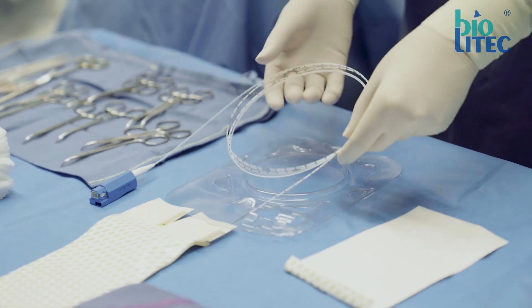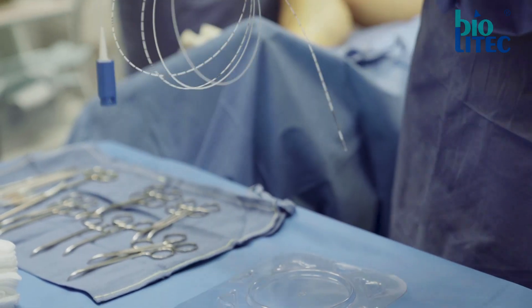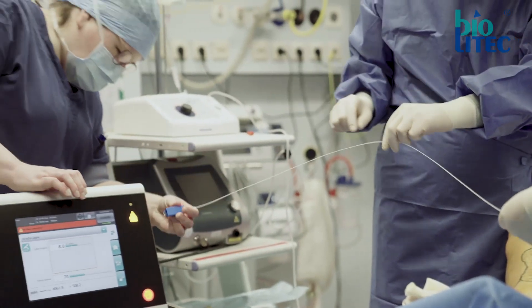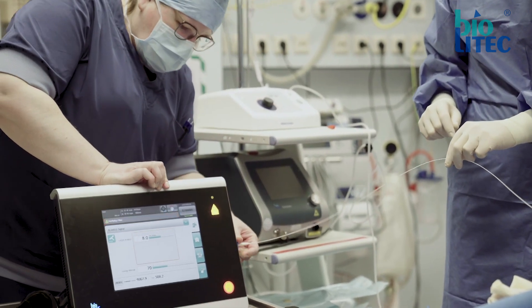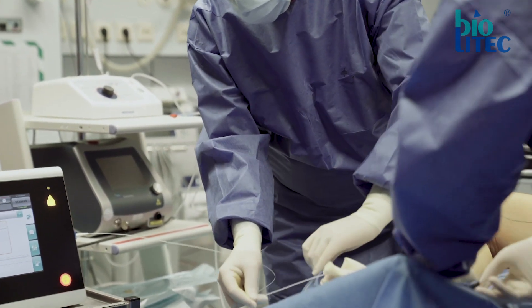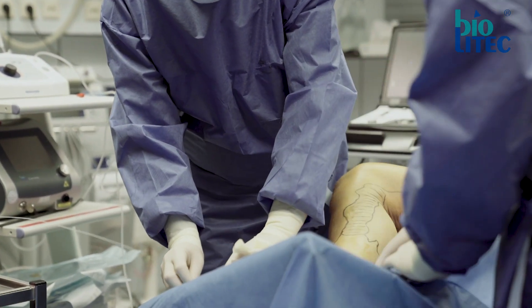We use a compact 1470 nm diode laser in combination with a slim double ring radial fiber. In our experience this leads to excellent results when it comes to efficacy, reliability, and postoperative pain.